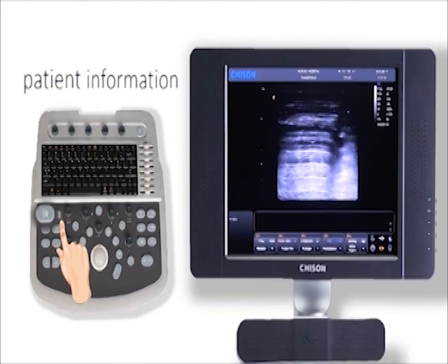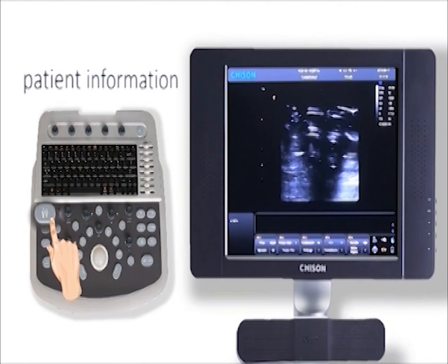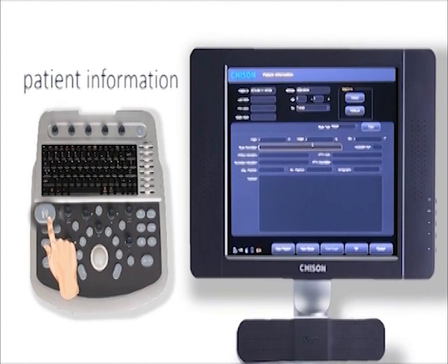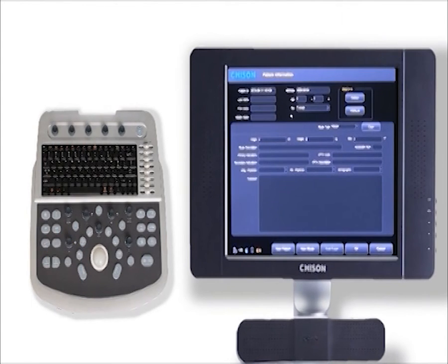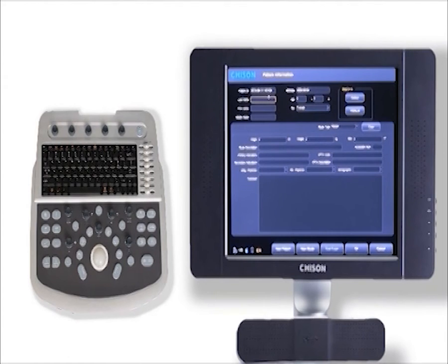Push the patient button to get into the patient information screen. Now it automatically shows a patient ID. I need to input last name, first name, sex and age.